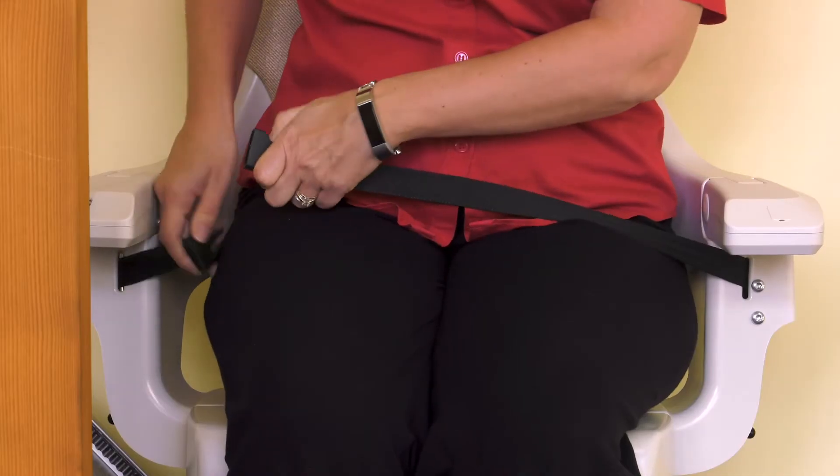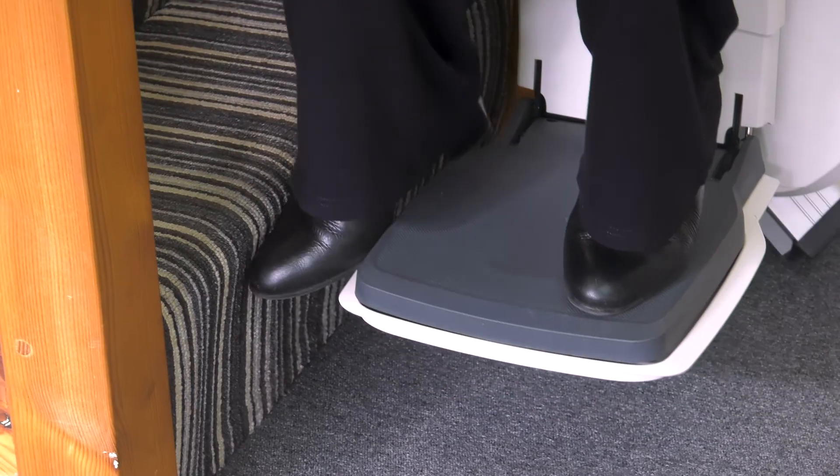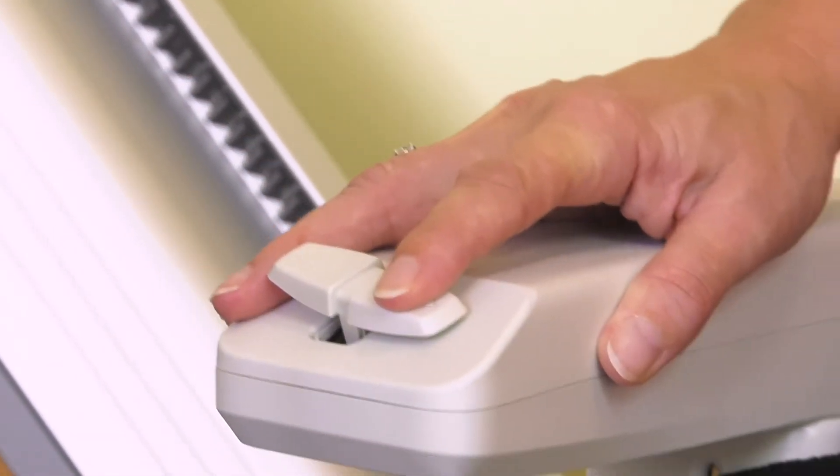Are stair lifts safe? Of course they are. The Home Glide has a seat belt to use in travel. There are safety edges around the foot plate and carriage, so if you meet an obstruction on the stairs, it will stop automatically to prevent trapping hazards. The controls are constant pressure so you can stop the lift at any time by releasing the controls.